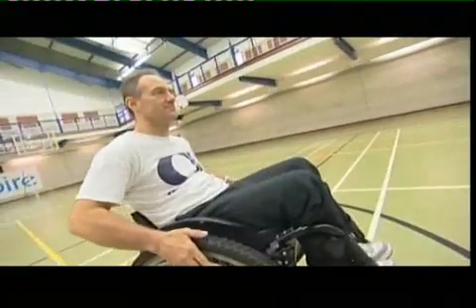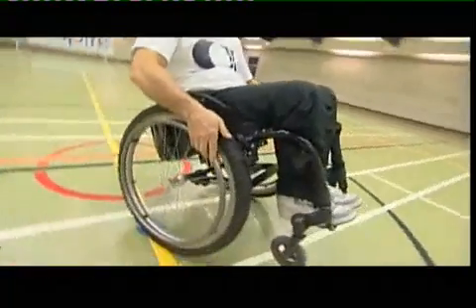Unfortunately, the excitement of that particular day was brought to a crashing halt by the arrival of a man called Gibbons. He wanted to test our wheelchair, and he got in it and he flew across the gym at very high speed. And as soon as he did it, it became obvious we had a wheelchair that wouldn't go in a straight line. This thing was like driving a tea trolley around. It was a complete and utter disaster.